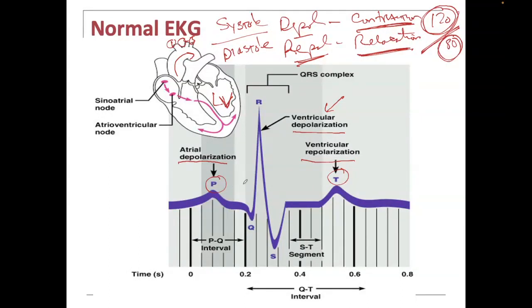Okay, so a cardiologist is looking at the PQRST waves, not just one of them. They're looking at many cycles of this. They're looking for patterns. Nothing is diagnosed based on just one abnormal pattern. They need to find many. They need to find a sequence of these patterns. Maybe they find an abnormality to the PQ interval, meaning the space between the P wave and the Q wave is called a PQ interval. Maybe there's an abnormality to this QRS complex. Or maybe there's abnormality between the S and the T called the ST segment.